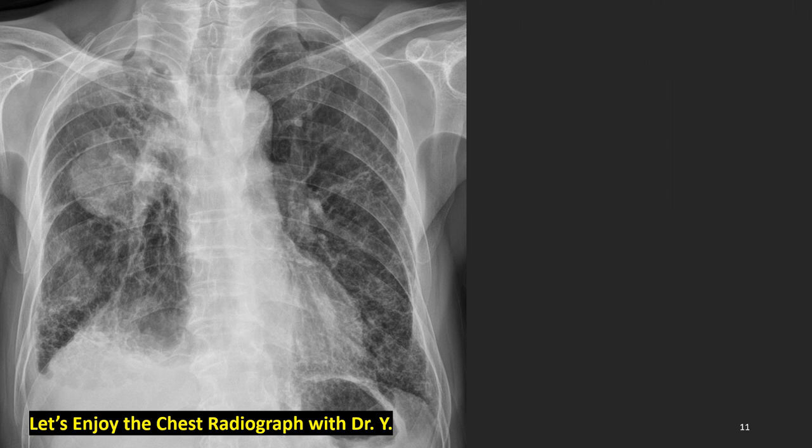What do we see? Just looks like an old man. Large mass, more than 5 cm, right above the minor fissure. And second, emphysema. And third, lower basal area with honeycomb, interstitial lung disease, or UIP, usual interstitial pneumonia, and pleural effusion on the right side. And also the tuberculosis scar at the apex. We sometimes call this the smoking, cigarettes trinity: emphysema, interstitial lung disease, and lung cancer. It may be said as trinity.